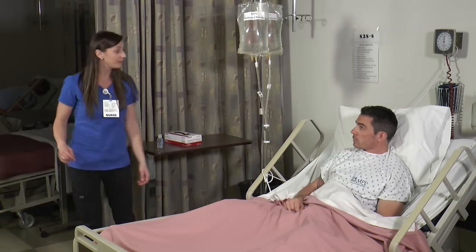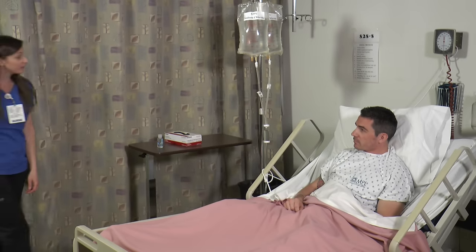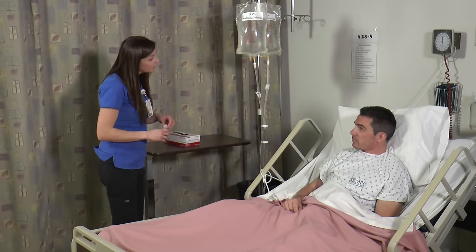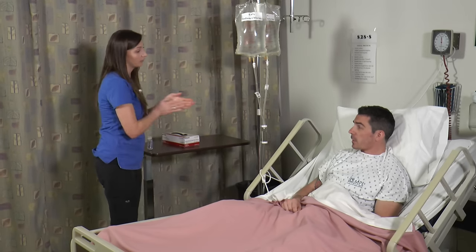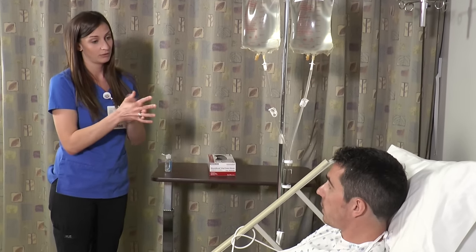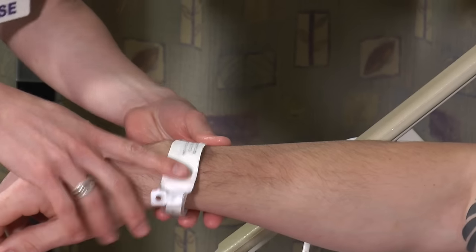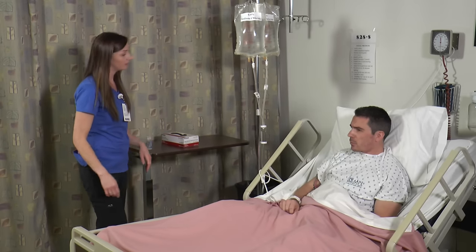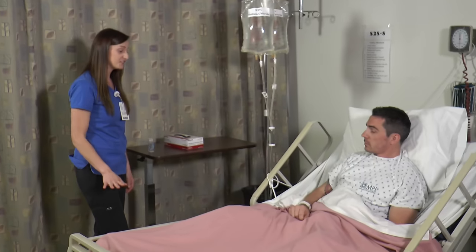Hi, Mr. Miller. My name is Megan. I'm going to be the nurse who's caring for you today. Can you please tell me your full name and your date of birth? Of course, Megan. My name is George Miller, and my birthday is January 20th, 1961. All right, how did you sleep? Not too bad. Surprisingly, the catheter didn't bother me too much during the night. Good, that's good to hear.